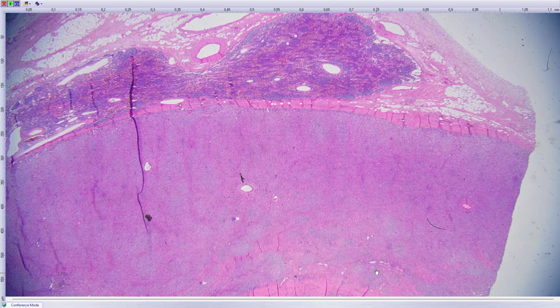Okay. Next case. We are already moving a little bit in the lymphoid area, but still also staying in mesenchymal a little bit. So this is a 45-year-old lady. She had a 13 centimeter large, but very well circumscribed tumor in the radix of her mesentery. There was a punch biopsy done somewhere else in Czech Republic, and from the punch biopsy, which kind of looked a little bit worse or a little bit more aggressive than what I will show you here, the punch biopsy diagnosis was undifferentiated pleomorphic sarcoma, or undifferentiated spindle cell sarcoma, so high grade diagnosis.